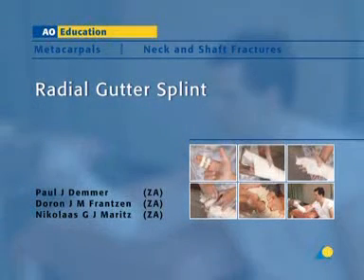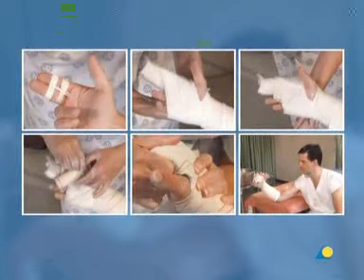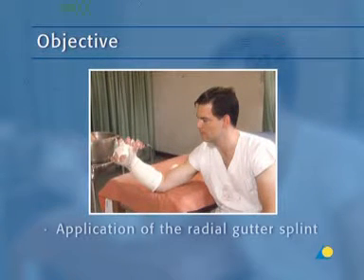The radial gutter splint is used to immobilize the metacarpals on the radial side of the hand. In this presentation, the application of the radial gutter splint will be demonstrated. The objective of the exercise is to show the application of the radial gutter splint, a plaster splint that will immobilize the metacarpals on the radial side of the hand.